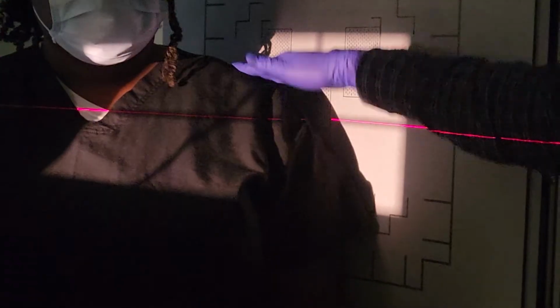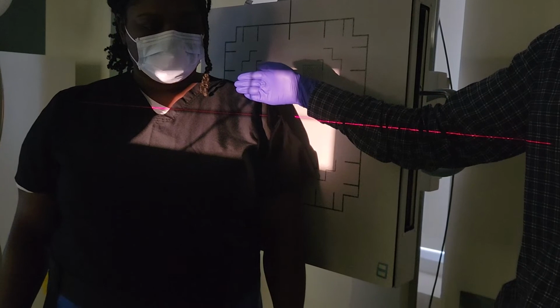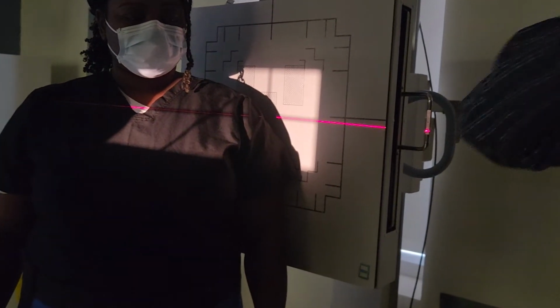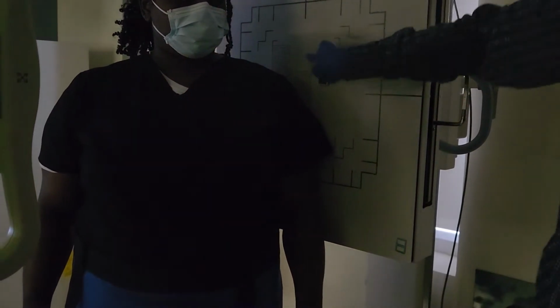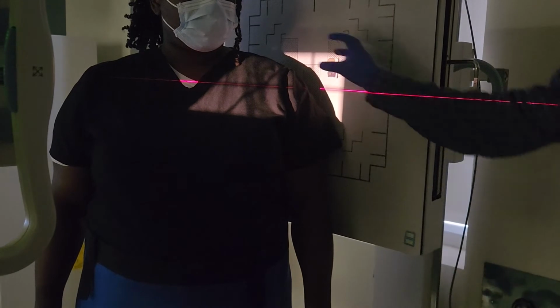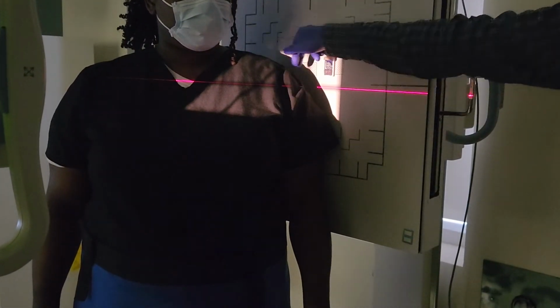All right, so top of the shoulder, 2 inches down, side of the shoulder, 2 inches inside. Make sense? Right? Just 2 and 2. Keep it nice and simple. And then from here, you can just collimate in to the joint and throw on your marker. Okay. And that is your Grashey. So the idea is that we've got the whole joint space right here, and we can see straight through it.